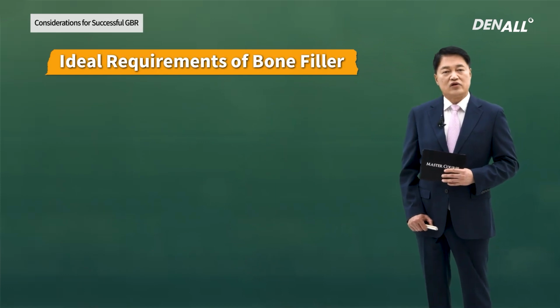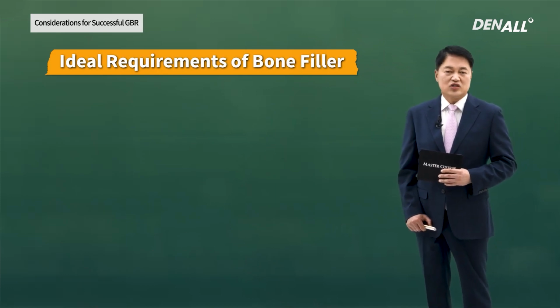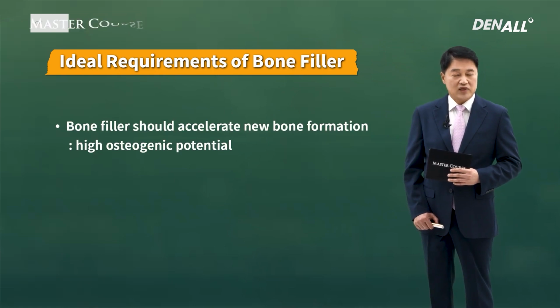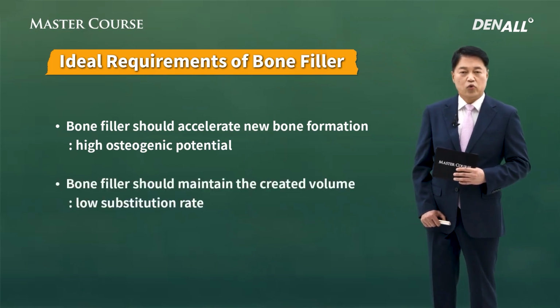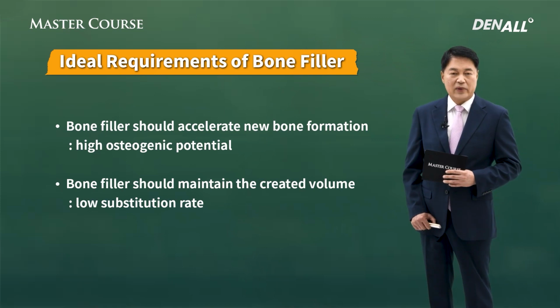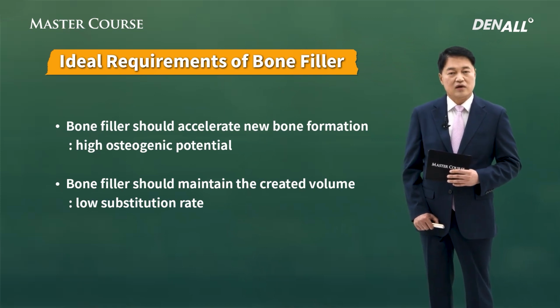Let's look at the bone fillers. There are requirements for that. First is high osteogenic potential. It needs to accelerate new bone formation. Another point is it should maintain the created volume. It shouldn't be resorbed too quickly, and it should be maintained for the long term.